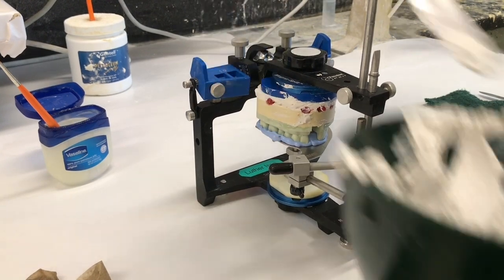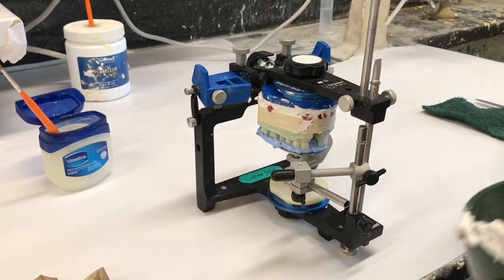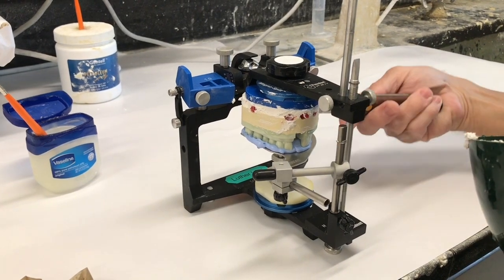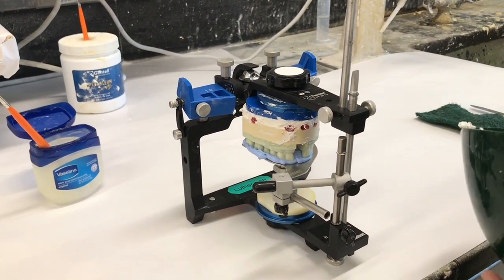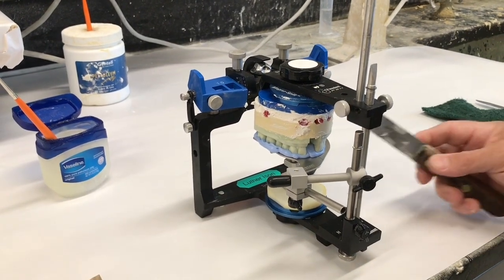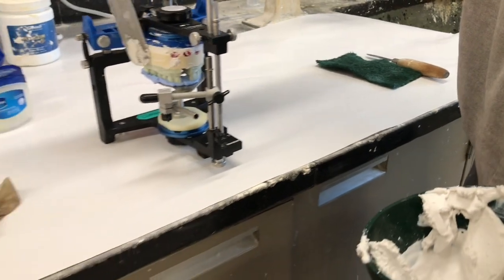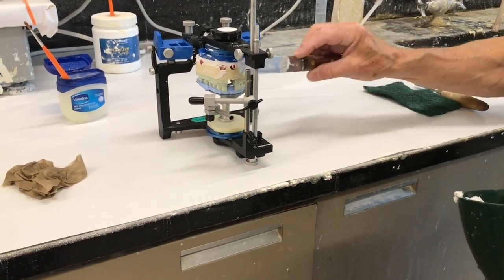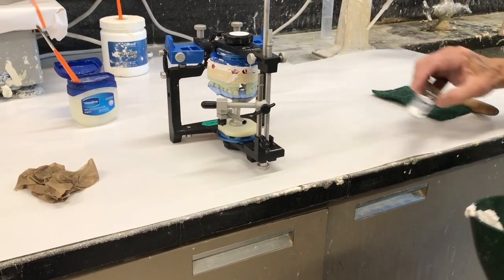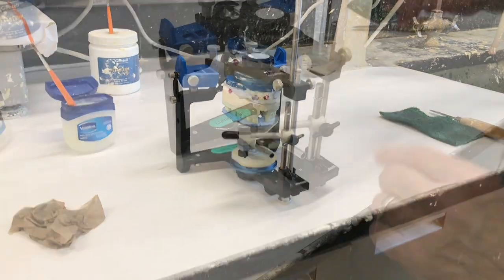Notice I'm not doing this with my fingers — I'm keeping my fingers out of it. Once it gets halfway set up, I'll refine it a little bit more and smooth things out. For the time being I want to let it set up a little. Then once it's halfway set, I can take and smooth it out with a little bit of water.